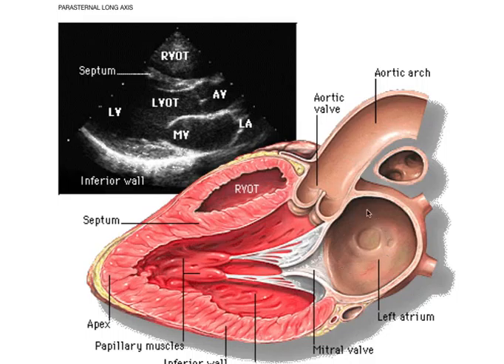In the parasternal long axis, we can see the left atrium goes into the left ventricle through the mitral valve. This is the anterior leaflet of the mitral valve, sometimes called the septal leaflet because it comes up next to the septum during diastole. And then this is the posterior leaflet of the mitral valve, and this is the aortic outflow tract seen right here, and then the right ventricle is seen up here, or on the ultrasound, LA, LV, aortic outflow tract, RV. The apex of the heart is seen down here.